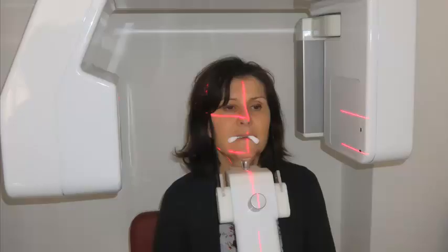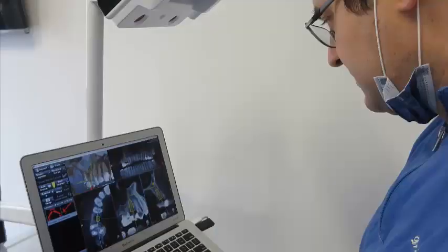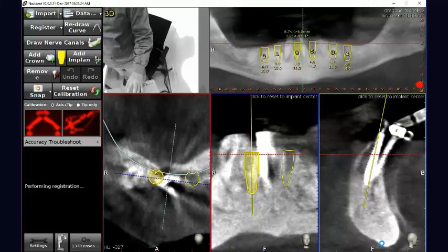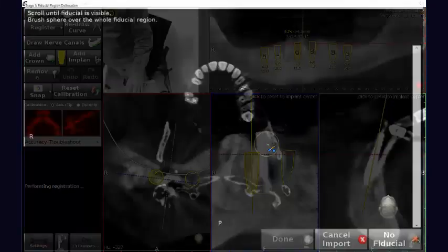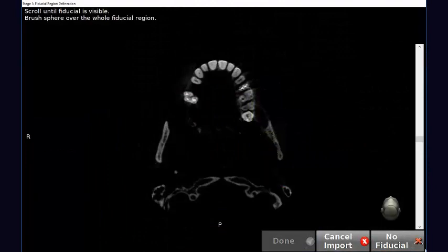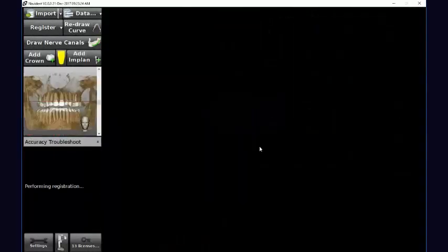We start by scanning a patient without any radiological stent, and therefore we collect and upload the DICOM files into Navident software. Once the files are uploaded, we enter a manual mode because there is no acknowledgement of the fiducials, and then we identify either the maxilla or the mandible.